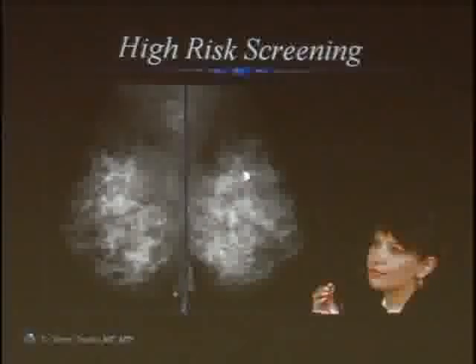And she's looking at it going, looks exactly the same on both sides, right? There's the CC view, classic standardized views, nothing. Let's look at that one breast. Here's the MRI. Now, MRI is all about enhancement, and I can tell you that women who lactate and women who are young can have enhancement that's just incredible. Now if I do one breast, I don't know what that is. Thankfully, God gave you two. And the national standard is we do them both. Don't ask for one, not for a discount. The national standard is two.